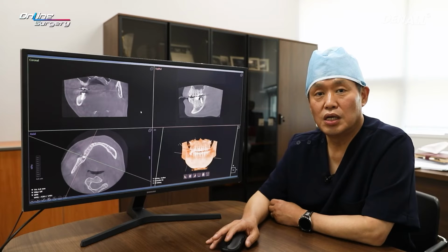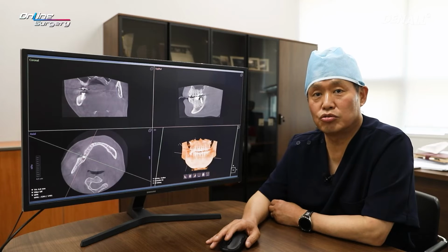In the case of most distal tooth, number 7, if you use OneGuide system or other digital guide system, you'll be able to do surgery in a most accurate way. Let's look at the surgery video.